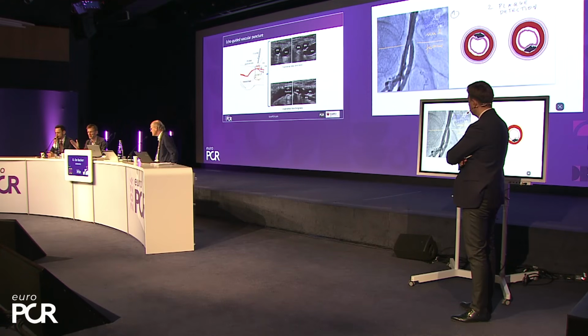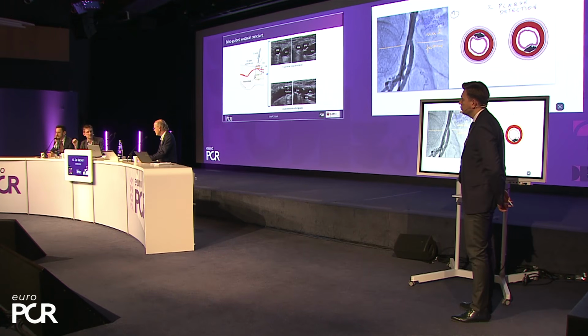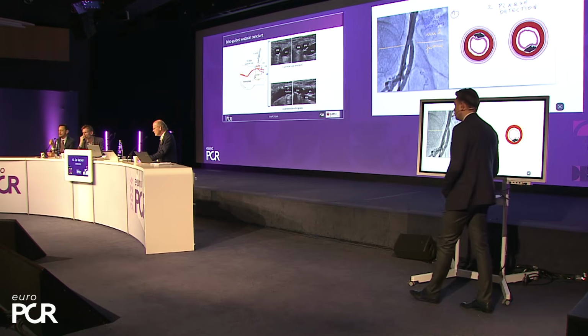The whole issue is, if you puncture within a centimeter of the femoral bifurcation and you have an issue and have to go over to stenting, for example covered stenting, then you stent over the profunda. So I would do anything, really anything, to avoid puncturing in that 1 centimeter above or below the femoral bifurcation, and then I will find a spot. I even prefer to puncture in the superficial artery, which I've done a couple of times in very obese patients, where you cannot reach the common femoral because of so much adipose tissue. I prefer even that to puncturing very close to the femoral bifurcation. You jeopardize all your chances of bailing out yourself at the end.